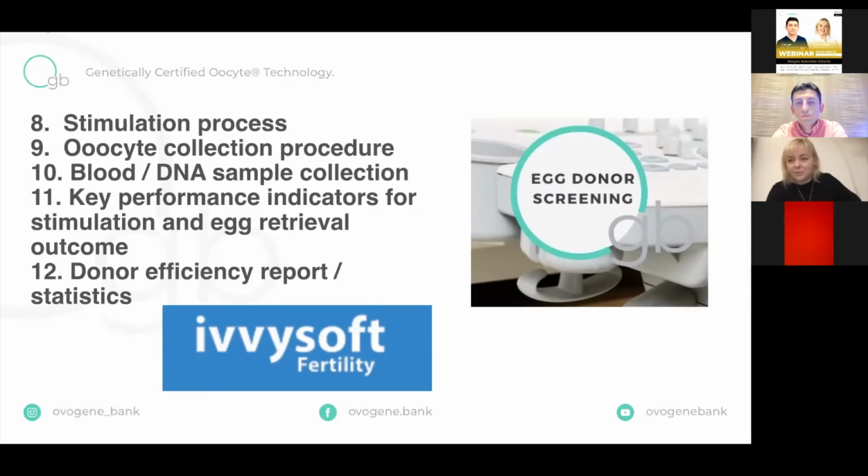We are getting the reports, we are analyzing them, and we have exclusion criteria: in case two different sets of oocytes had survival, blastulation or clinical outcomes that we consider non-optimal, and warming of those sets was done in two different locations, we exclude this donor from sending those oocytes somewhere. We evaluate the outcome once again.